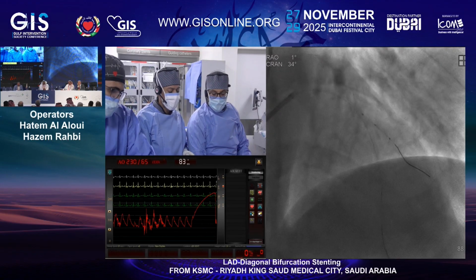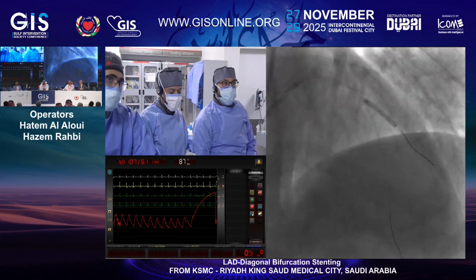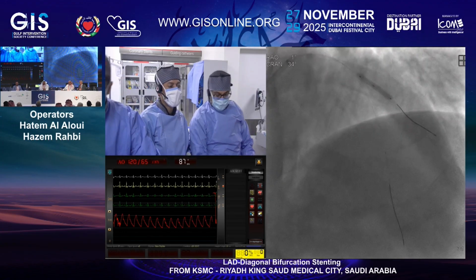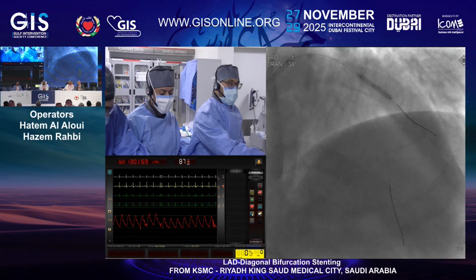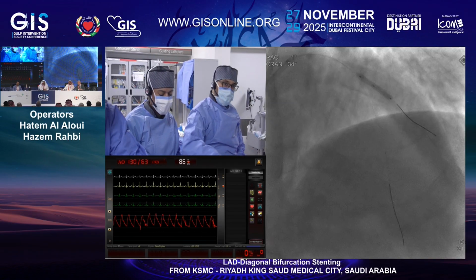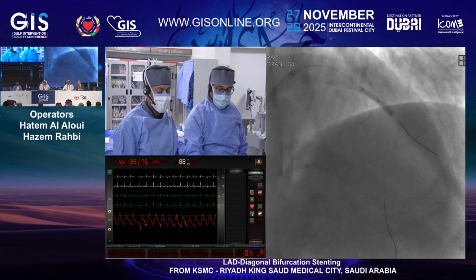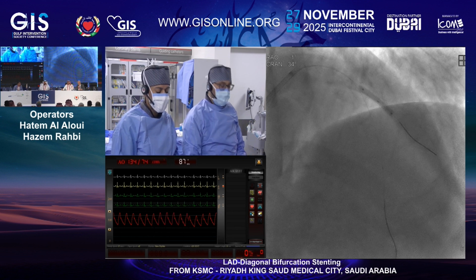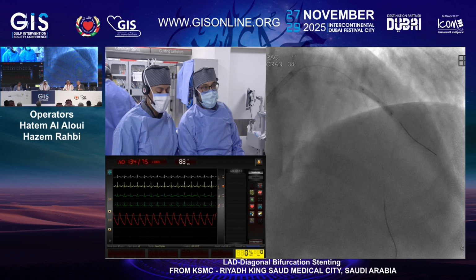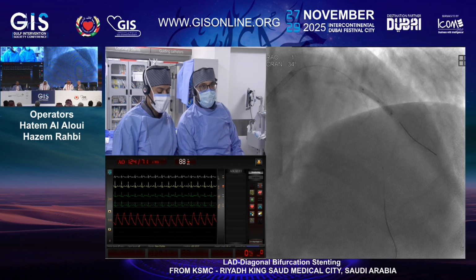Go ahead. Okay. For how many seconds? We will stay 60 seconds if the patient tolerates, of course, no chest pain, no ST elevation. Actually, for this balloon especially, they have data that 30 seconds are enough. But as Dr. Hatem is doing, we applied for 60 seconds. Patient is okay. Down, please.